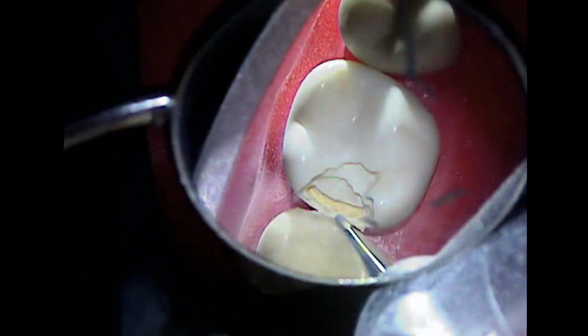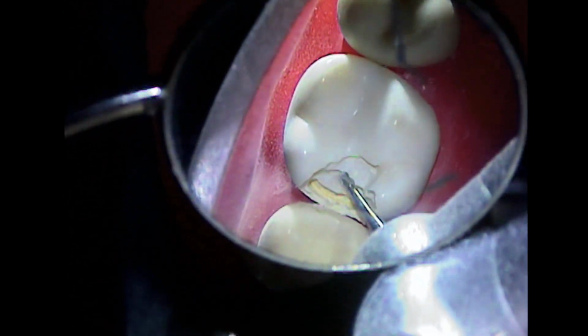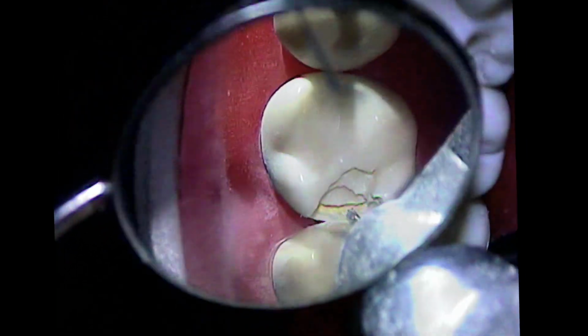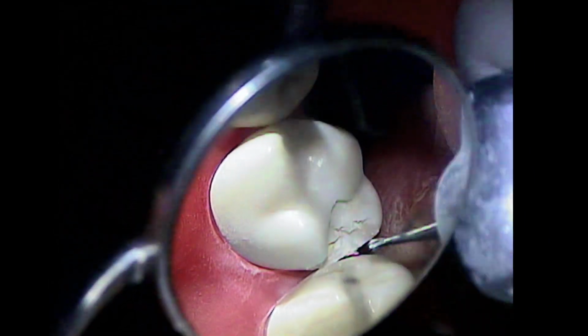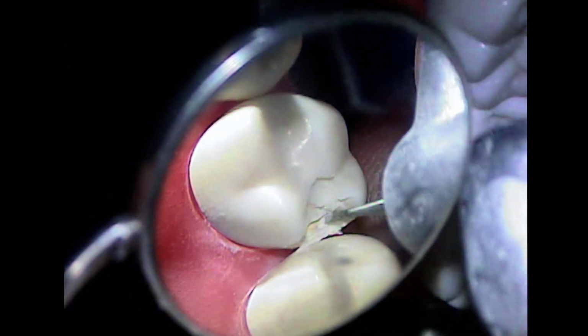So there's where the axial wall should have been, right? Yep. What's it doing way over here? Okay? Yep. So again, if you're trying to look down the axis this way when you're doing it, you're going to overextend axial, you're going to undercut the axial, you're going to damage the adjacent tooth like this. So all those things happen when you try to look down the axis. If you look this way the way I am, then none of those things happen and everything works out beautifully.